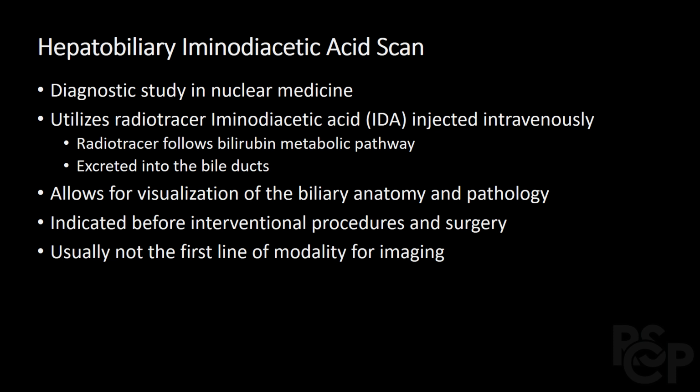This tracer is injected intravenously, and eventually the radiotracer is followed because it takes the path of the bilirubin metabolic pathway, and it's excreted into the bile duct. So this allows for visualization of the biliary anatomy and pathology.